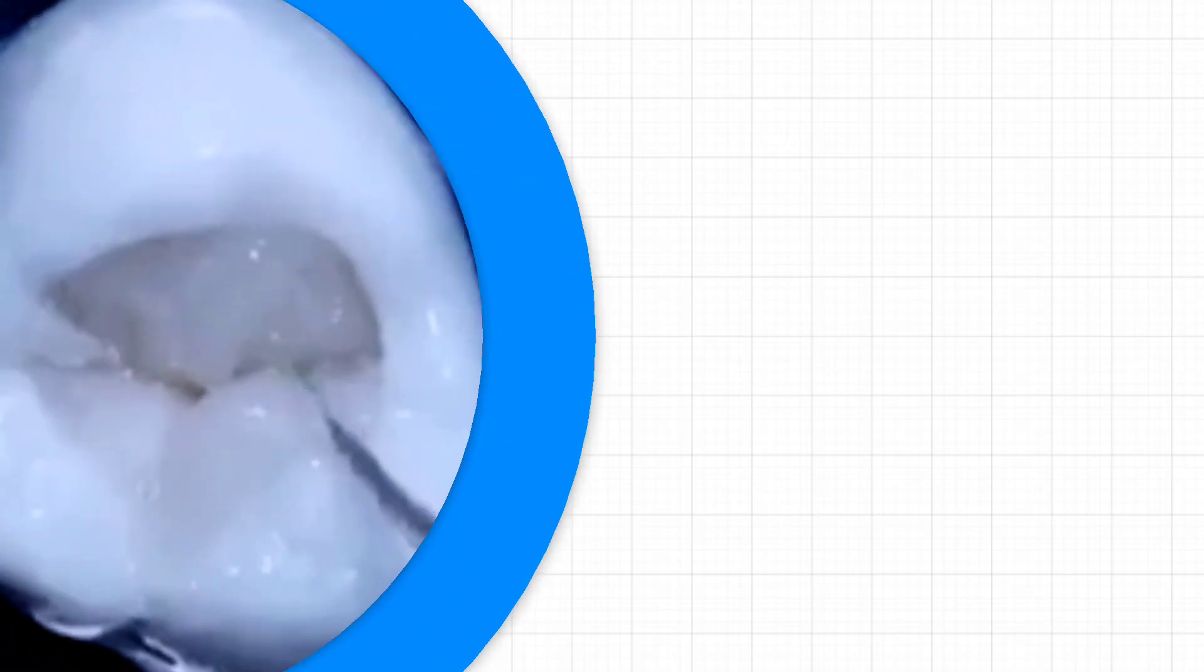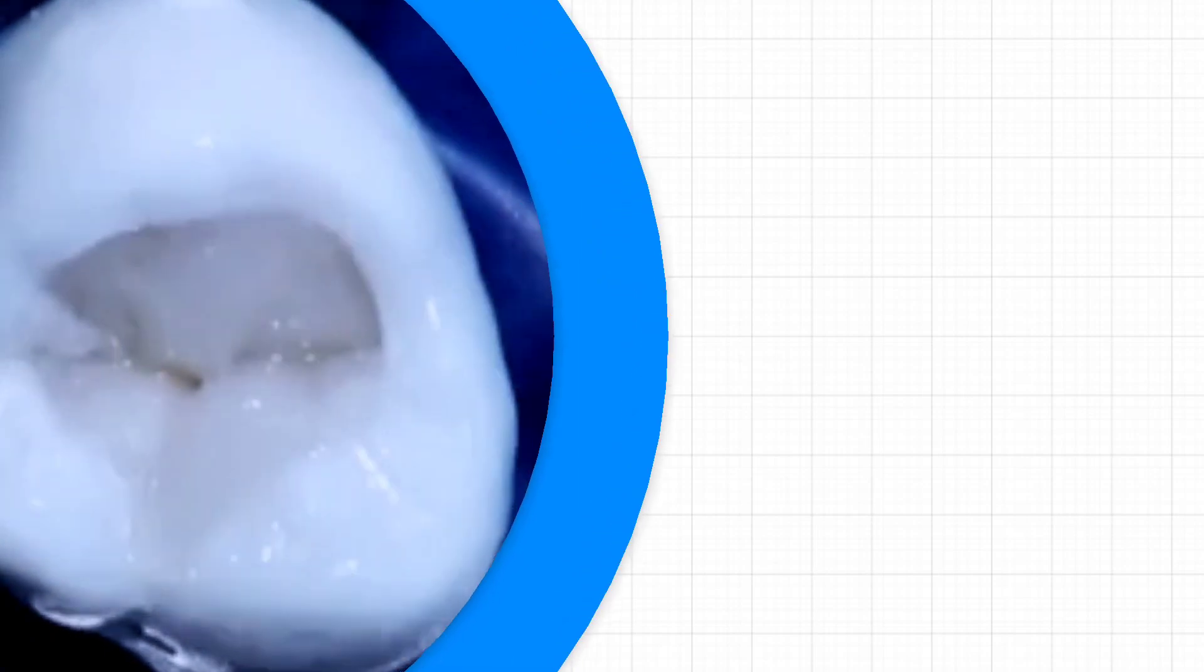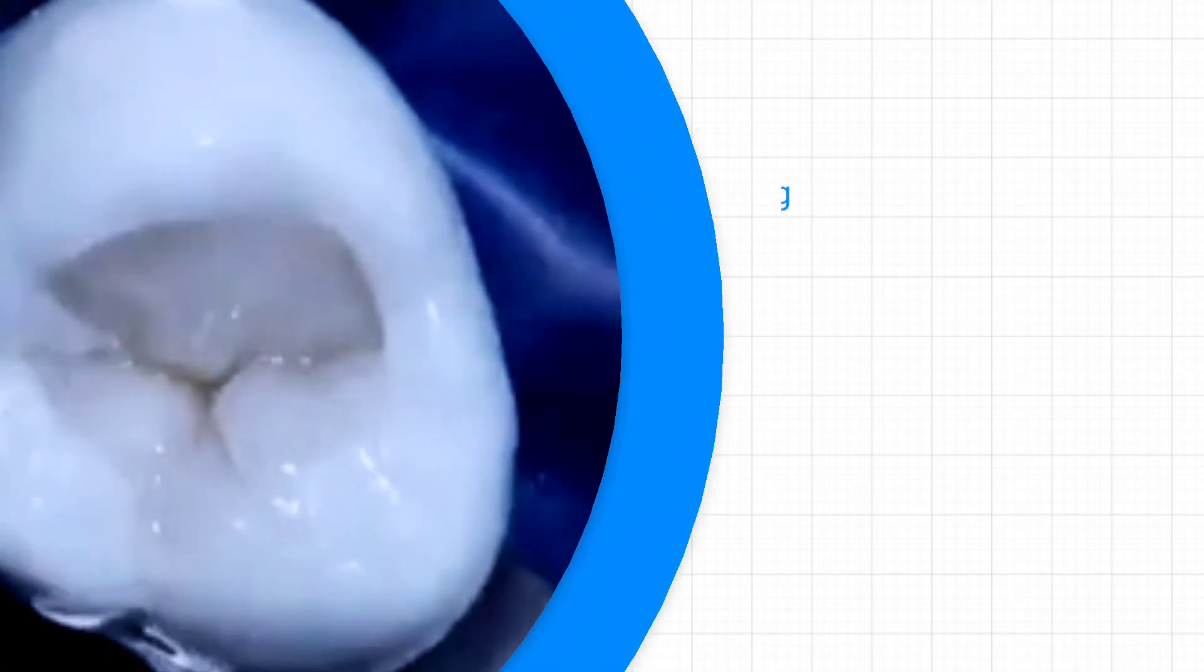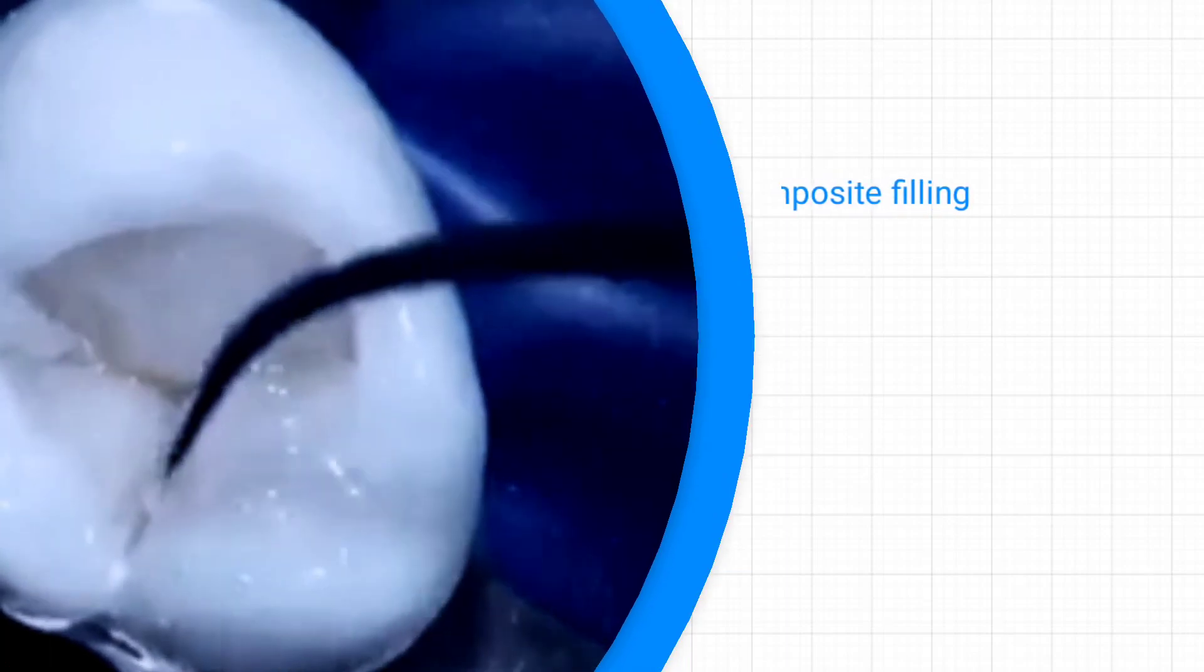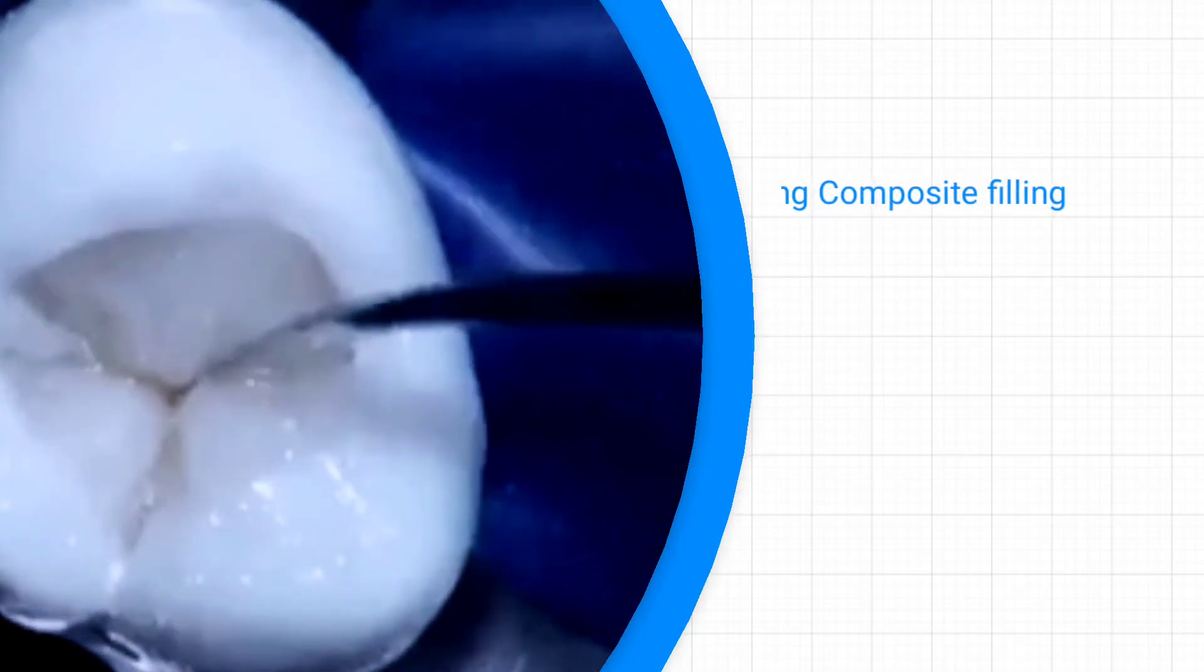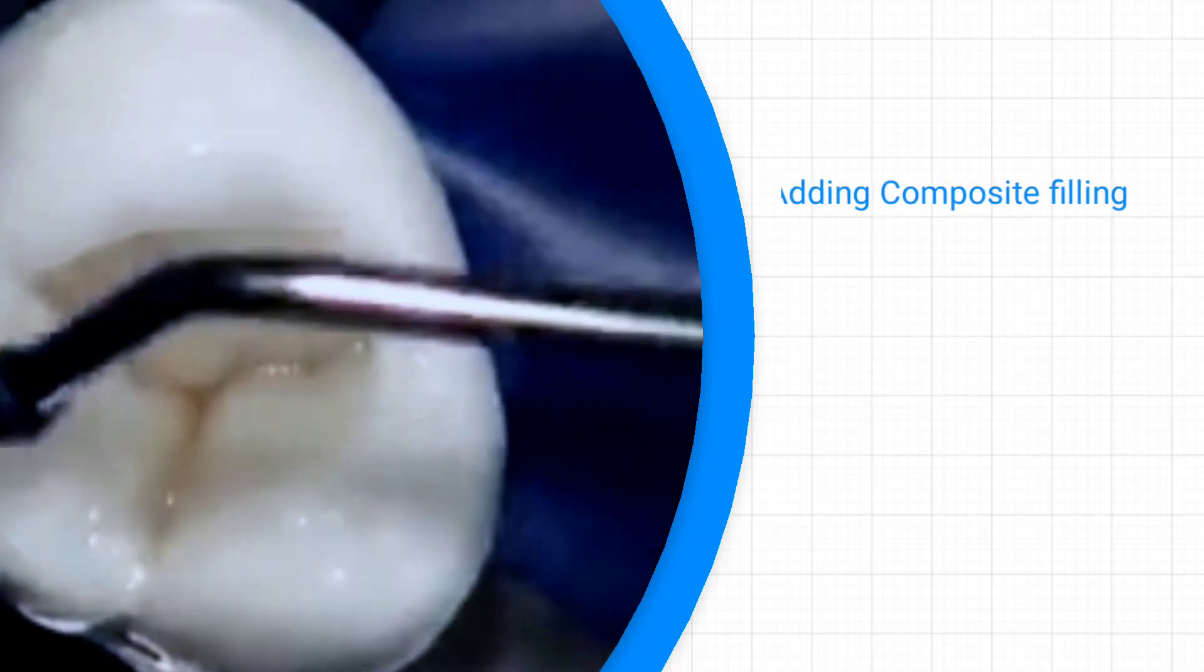The tip for a good composite restoration is that the tooth surface must be cleaned before you start the restoration. Preparing the tooth starts by polishing the tooth surface. Remove any stains, plaque, calculus, or debris. Clean as many sticky fragments as possible before you start with the composite restoration so that it adheres to the tooth.